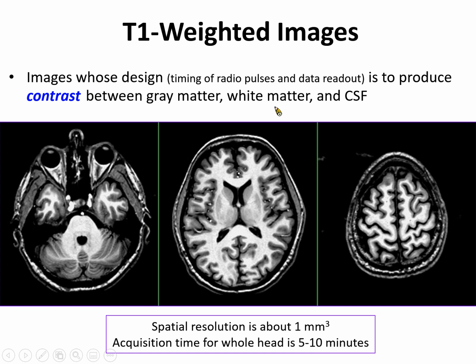So what is the gray matter? In these MRI images, you can intuitively see a thin layer of gray tissue surrounding our brain. And inside this gray tissue, there's white tissue spread across a large part of our brain.